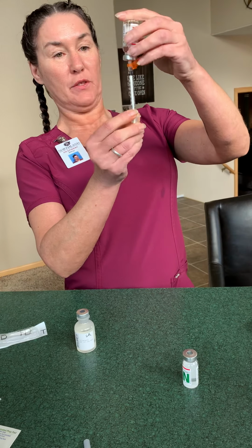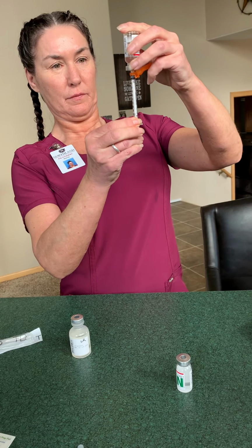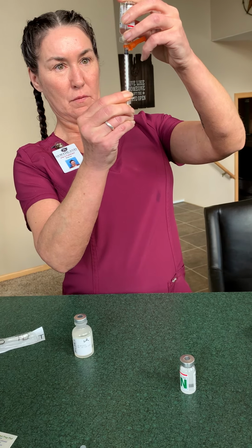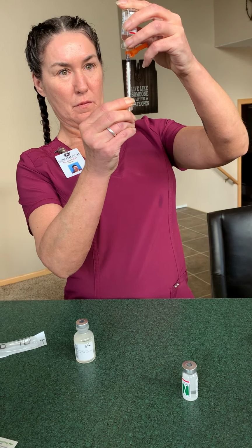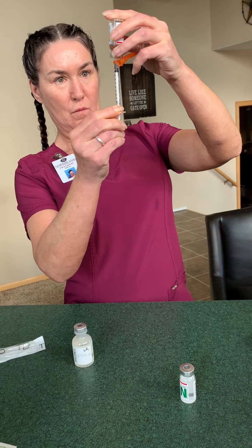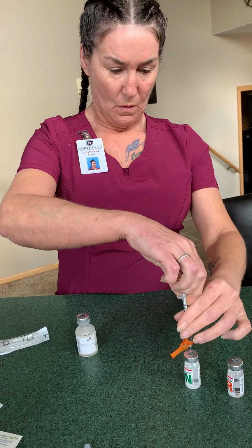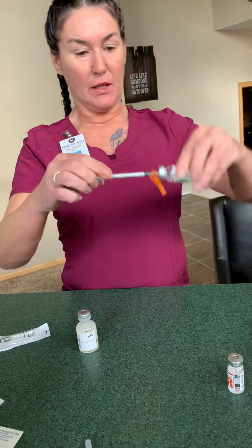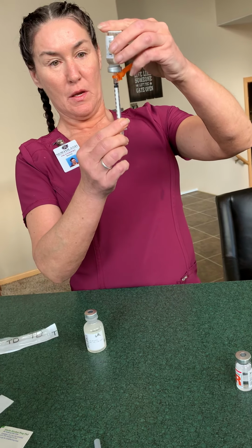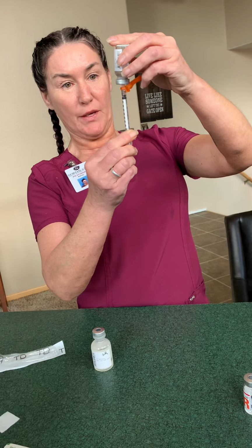And drawing up our solution of regular first. You always want to go clear to cloudy because you never want to get the cloudy mixed into your clear. So now I'm going to draw up 16, which added would bring us to a total of 28.